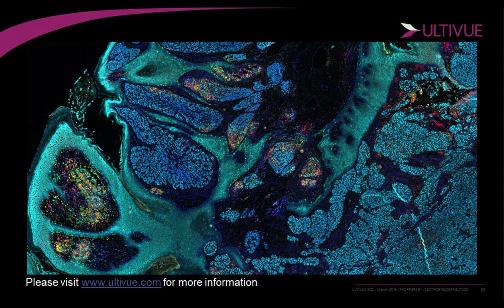And our signal over background, regardless, is significantly higher than the background. So when you're doing your threshold, having very specific and localized signal is something that will be very clear for you. It would be very difficult to do a straight quantitative assay if you have an antibody that has extremely low binding efficiency. It may not be the best clone to be using in the first place. But as far as being able to detect over background, you should have no issues whatsoever.